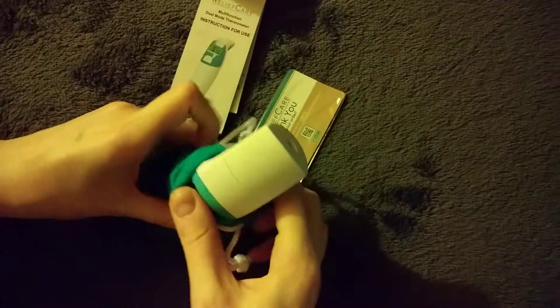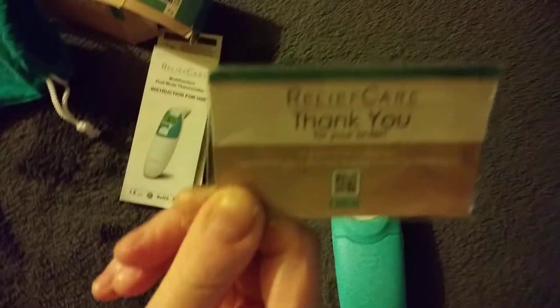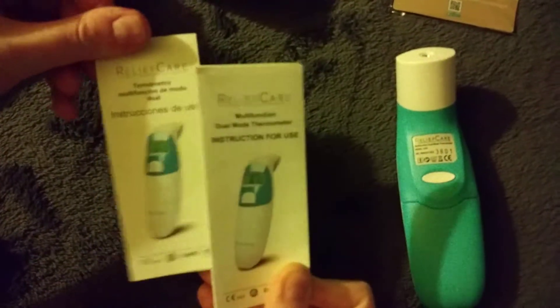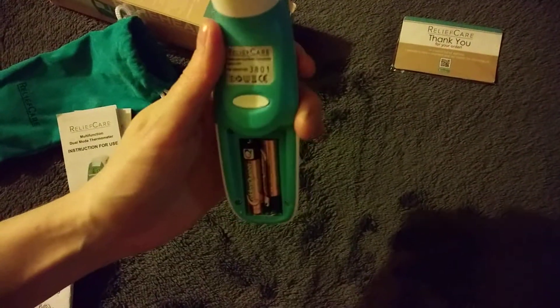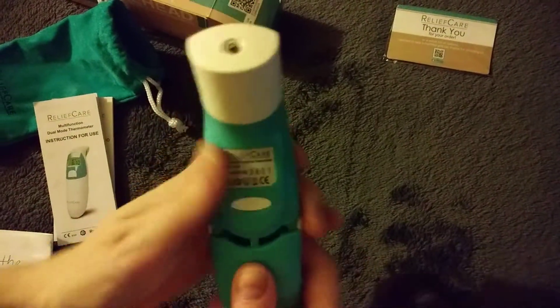Included in this box, you'll see the drawstring bag to keep your thermometer in and keep it nice and clean. There's also a little thank-you magnet from the company, and you'll find instructions in English and in Spanish. The company also puts two triple-A batteries in the thermometer, so it's ready to use once you get it.